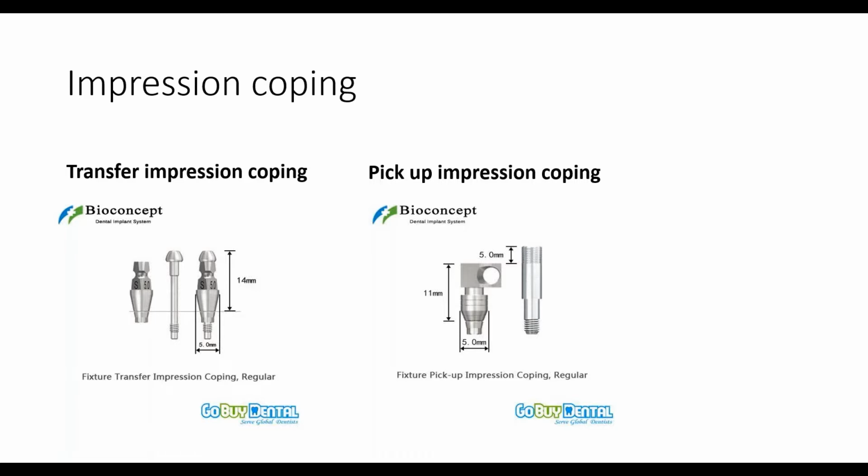Second, we have the pickup impression coping. Again, as the name suggests, we are picking up this impression coping with the impression. So the impression coping is first attached to the implant, and a hole is created in the plastic tray. Through this, a guiding screw is loosened and the impression is removed with the pickup impression coping.